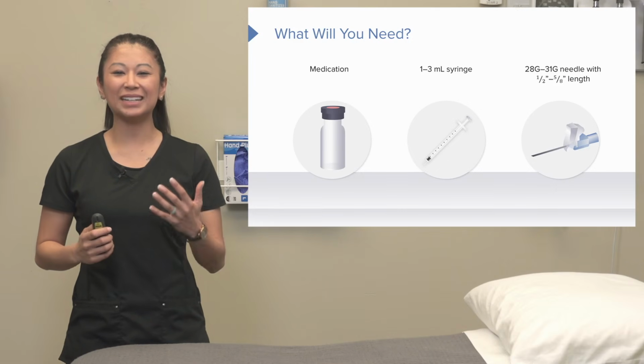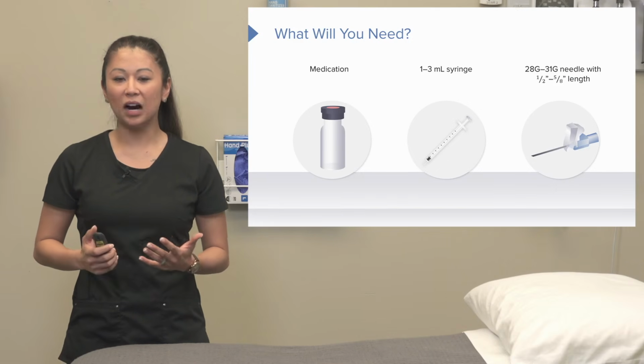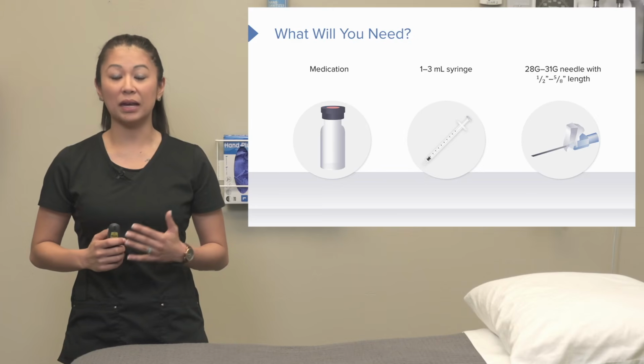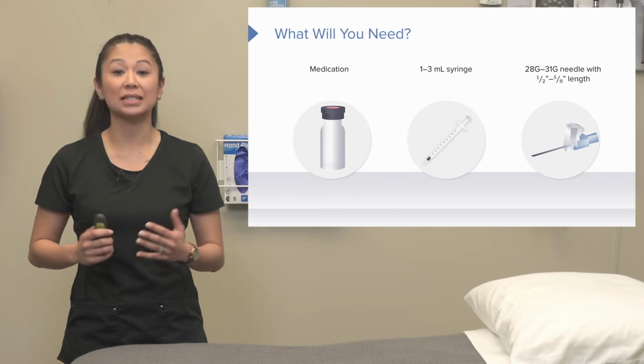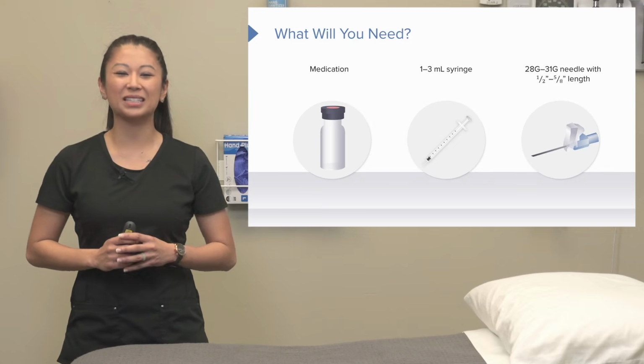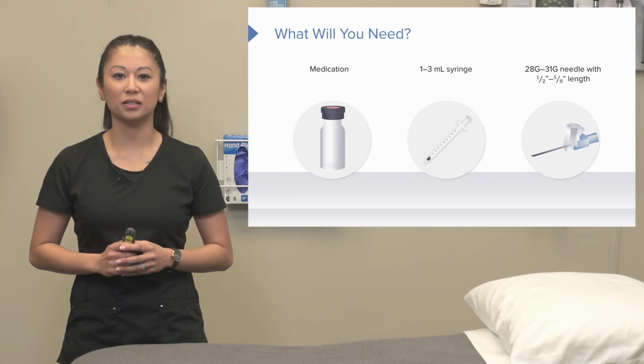You of course are going to need your medication. This is commonly going to be in the form of maybe heparin, for example, that's a blood thinner, or insulin for a patient that's diabetic. Those are really common subcutaneously administered medications.